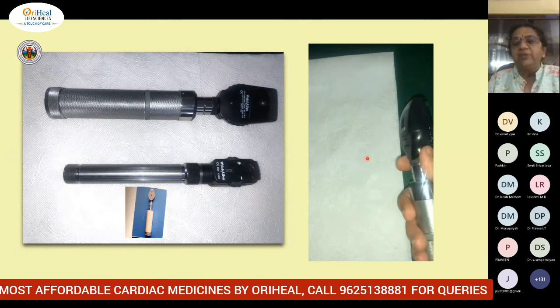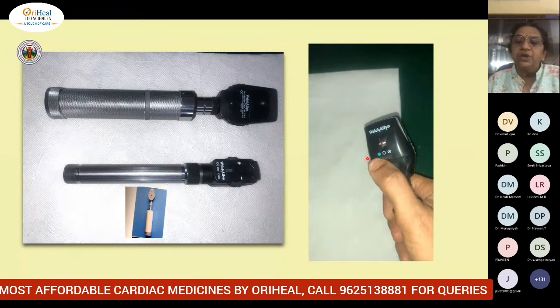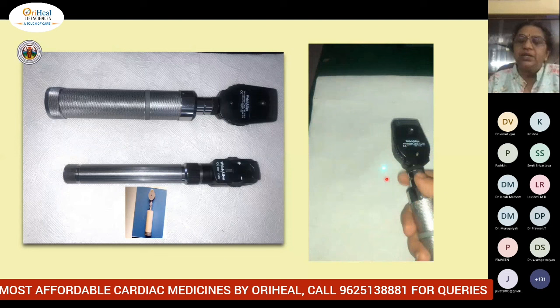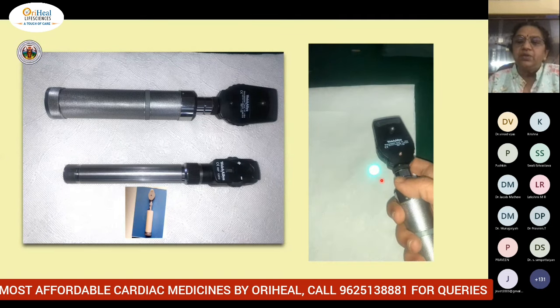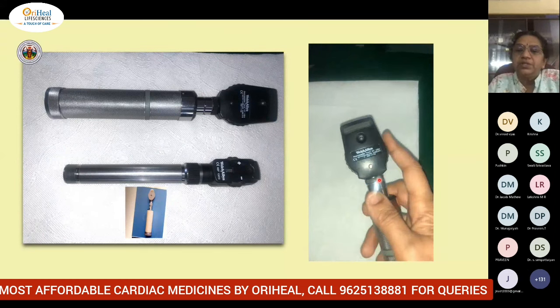Why we have different apertures is that when you get a rat, a lab animal, you have to refract the lab animal's eye also. There you have to use a small aperture. And again, the circular dial can be changed to the green color, and the size can be the slit, the larger aperture or the smaller aperture, which can also be adjusted in the amber colored part and in the slit.